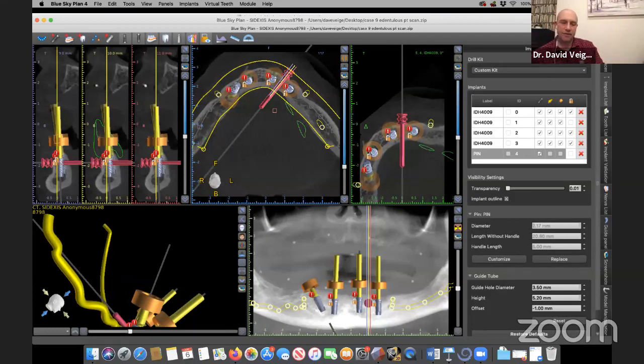Generally there's a range, anywhere from 0.5 millimeters, if I remember the data correctly, up to 6 millimeters, with an average of about 1.25 millimeters at the point of entry. The apex is about the same, 0.5 to about 6 millimeters, with an average of about 1.25 millimeters, and an angle of deviation of 3 to 4 degrees. So that's what the science says about the accuracy.